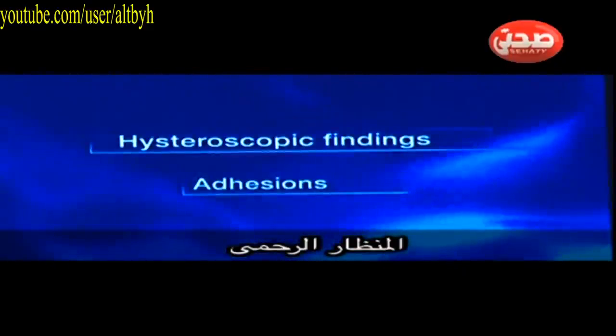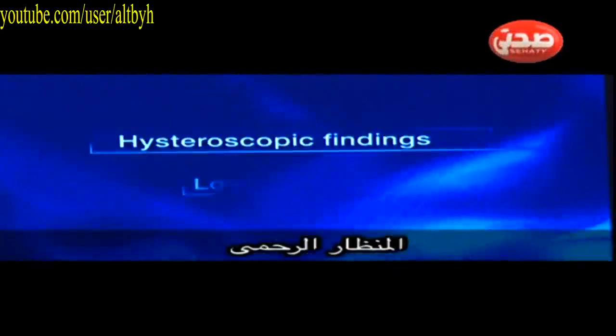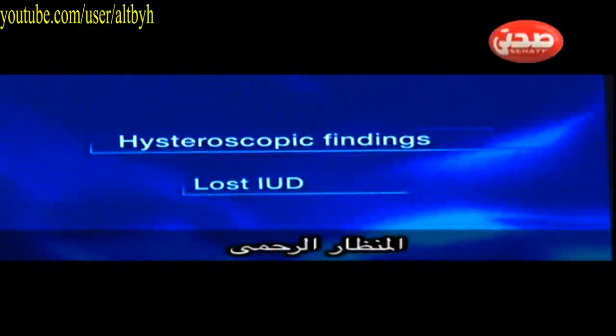Adhesions are also an important finding in the uterus, and you always have to comment on whether there are adhesions or not, especially if she had subfertility or a history of hypomenorrhea or dilatation and curettage. Lost IUDs are also one of the indications to do a hysteroscopy to try to remove them. As you can see here, there's a misplaced and missed IUD, which was retrieved successfully.